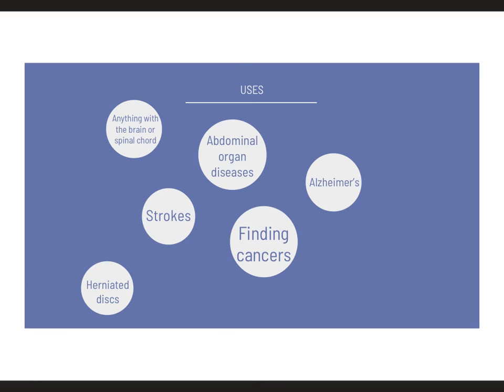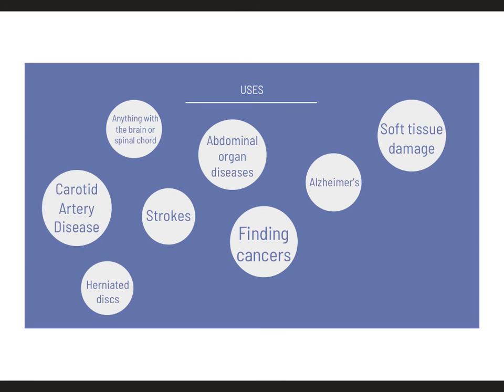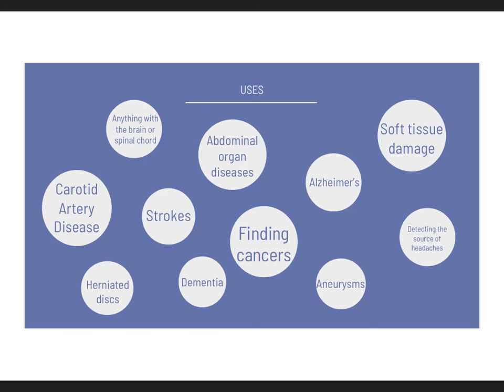Abdominal organ diseases such as liver. Soft tissue damage like cartilage and ligament. Carotid artery disease, aneurysms, detecting the source of headaches, and dementia.